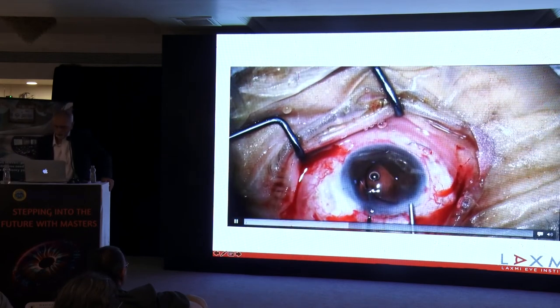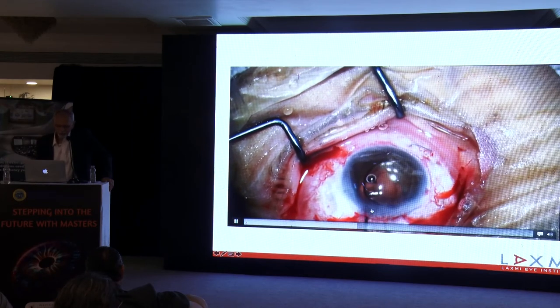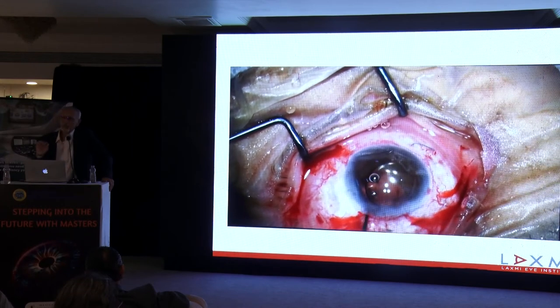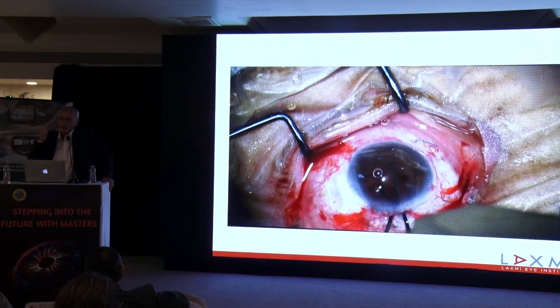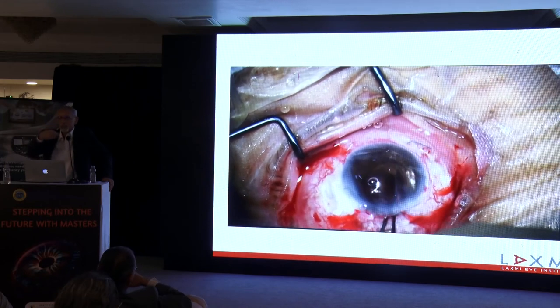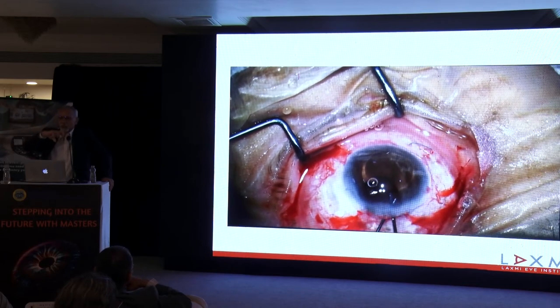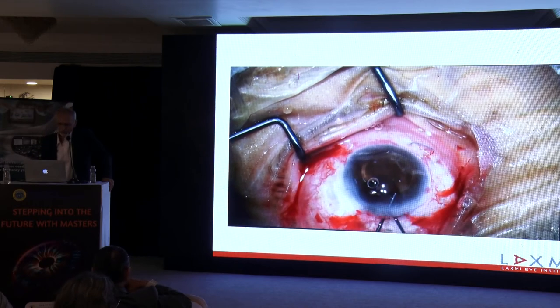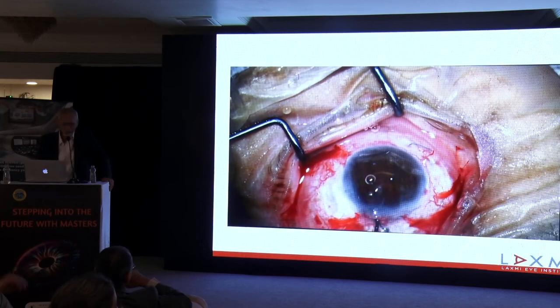And then of course the thing was to get this lens out. I had made a sufficiently big opening. It was not difficult to get this lens out. Especially when it is a glued IOL, the IOL is never really stuck there like a sutured IOL. If you try and just pull it, it can come out through that groove. So once one haptic is cut, to just rotate the lens out of that other groove is not difficult at any time. And I'm sure Ram would agree to that. You know, it's never stuck.